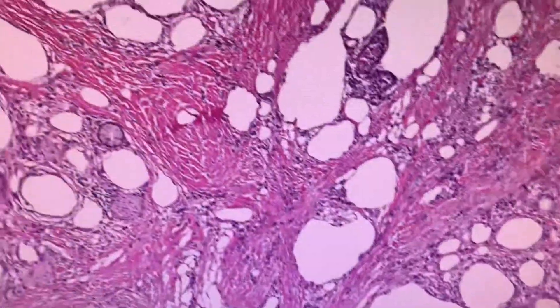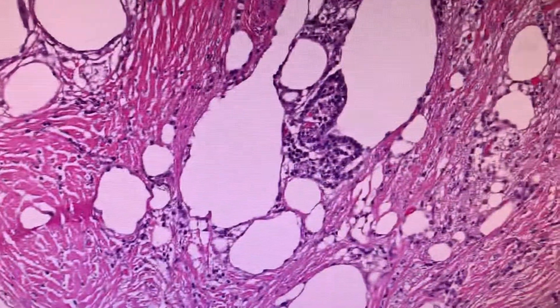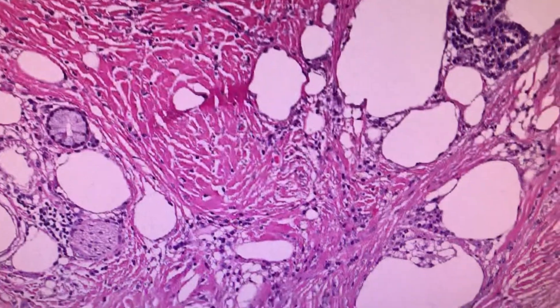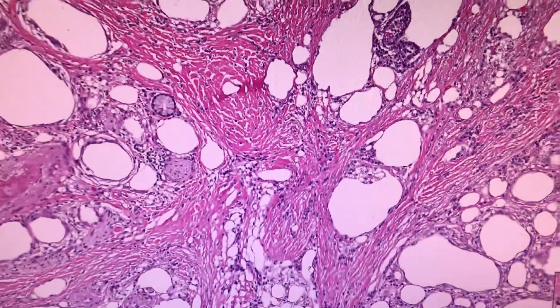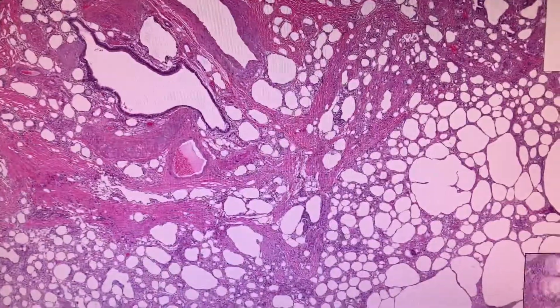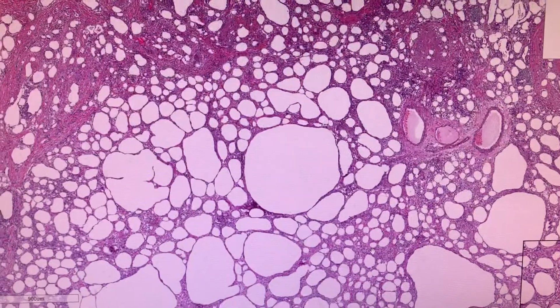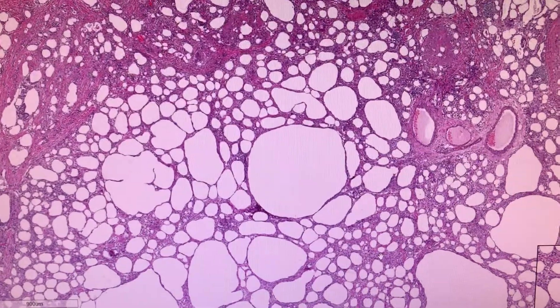I hope you remember that asteroid bodies are not specific for anything, and also I hope you remember what exogenous lipoid pneumonia looks like on a histologic slide. Burn this image into your mind, and I hope that the next time you see just garden variety foamy macrophages, you won't mistake them for true exogenous lipoid pneumonia as is seen in this case. Thank you!